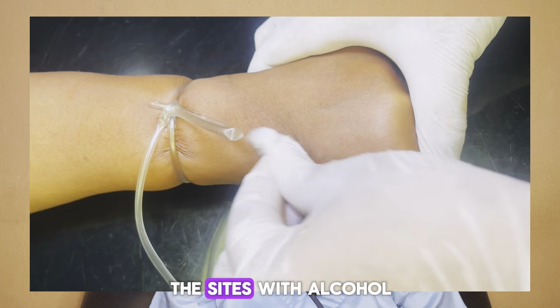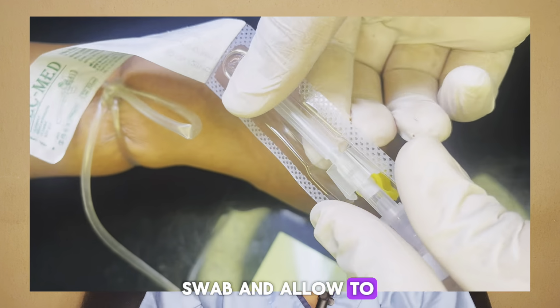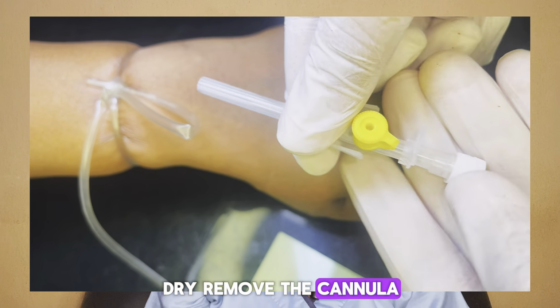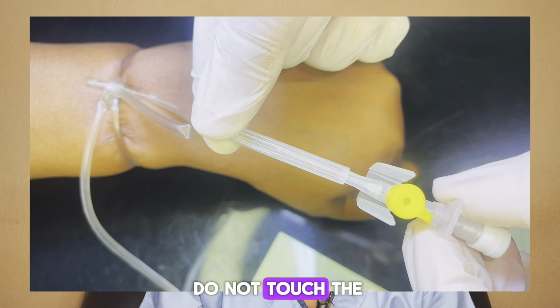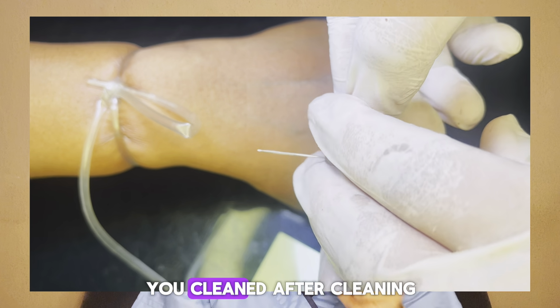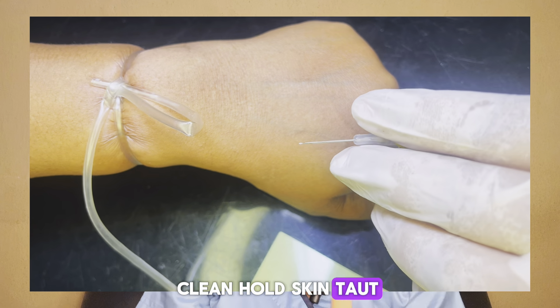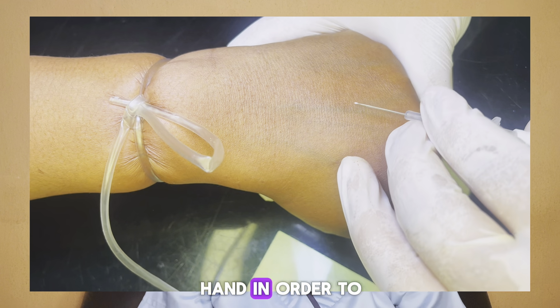Clean around the site with an alcohol swab and allow to dry. Remove the cannula from packaging. Do not touch the needle as it is sterile. And remember, the place you clean, after cleaning, do not touch that area again because it's already clean. Hold the skin taut with the non-dominant hand in order to anchor the vein.